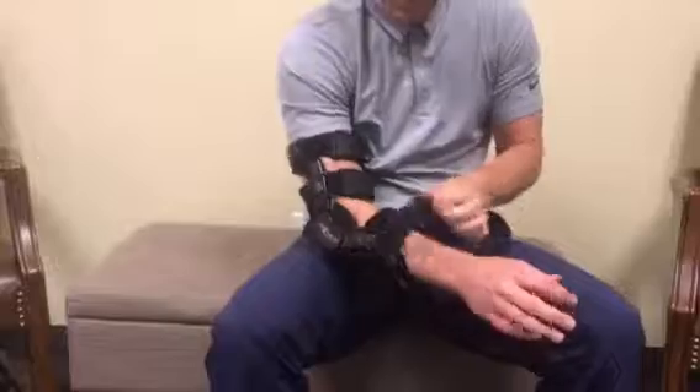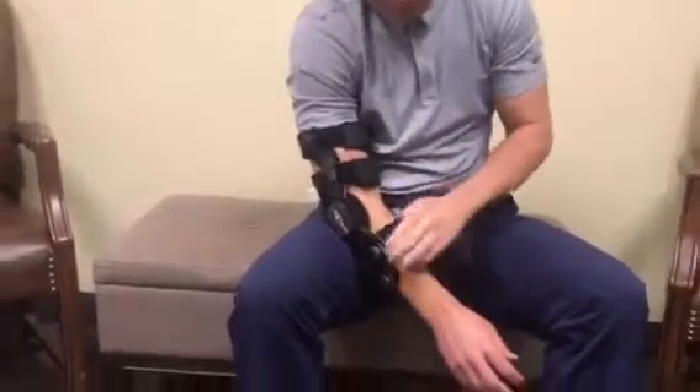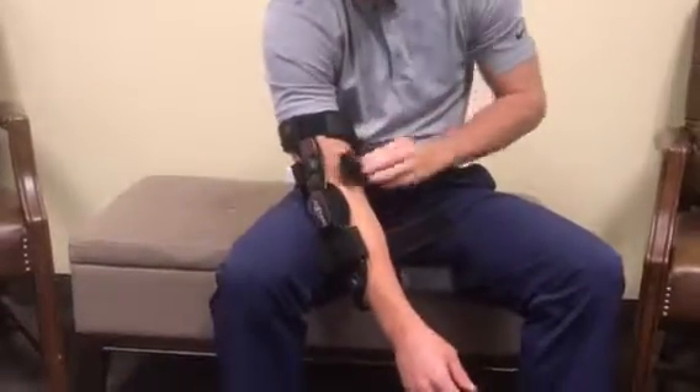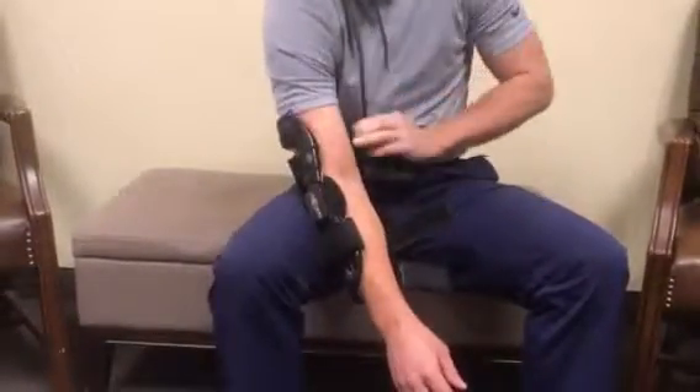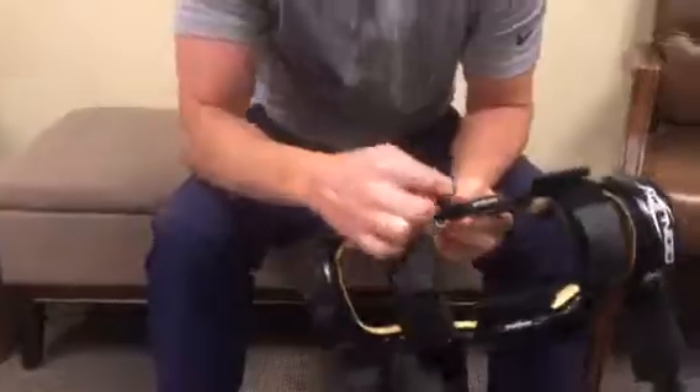If you need to install an extension stop, take it off here, remove all the interior straps, and you'll be able to doff it. Come into the interior — you can see that's probably a 20-degree extension stop, so it's stopping me from going into extension.